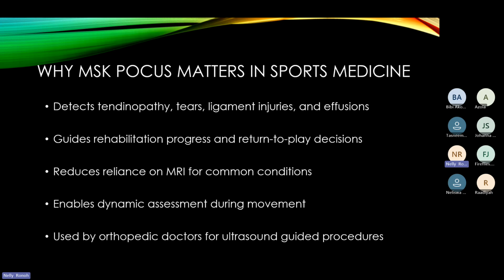Then we have, it enables dynamic assessment, as we've said, during movement, and it is used by orthopedic doctors for ultrasound-guided procedures, and not only orthopedic doctors, even physicians who work with sportsmen, because we will find them in our departments when they come for their checkups.